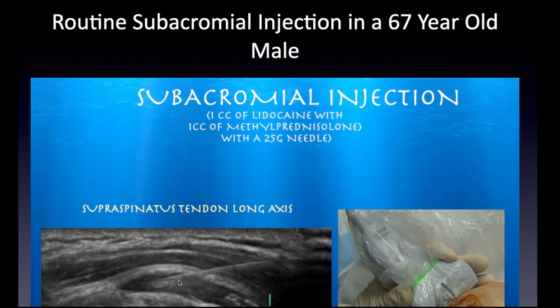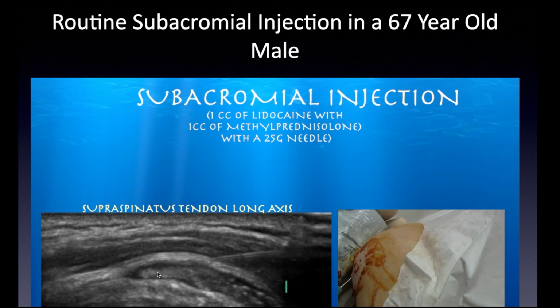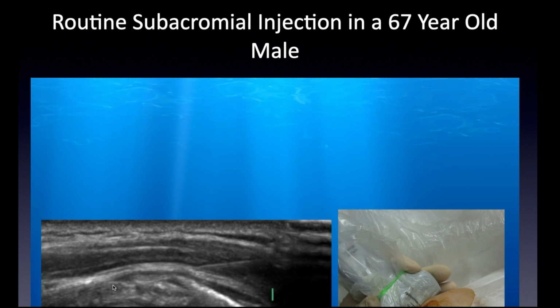Here we're injecting the subdeltoid bursa. You can see how much I'm really distending that bursa. I think part of the therapeutic effect is not just from the cortisone, but also from using saline, you kind of mechanically separate these tissue planes if there's inflammation and scarring. I think that provides a therapeutic effect as well.